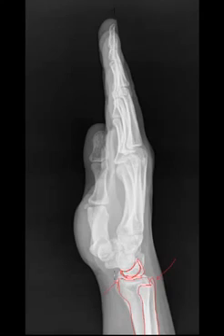The rest gets a little more complicated. Here's the scaphoid. We can only really see this portion of it without much overlap from the other carpals. What you see back here is actually the triquetrum. On lateral projections, with triquetral fractures you will often see a little flake back here. Triquetral fractures, also known as Fisher's fractures, are just fractures of the triquetrum, and typically you'll see the fragment in this location. So lateral projections can be very useful for that.